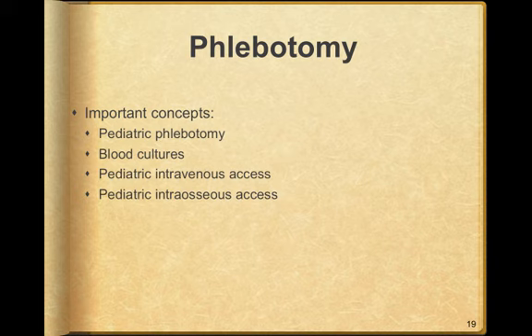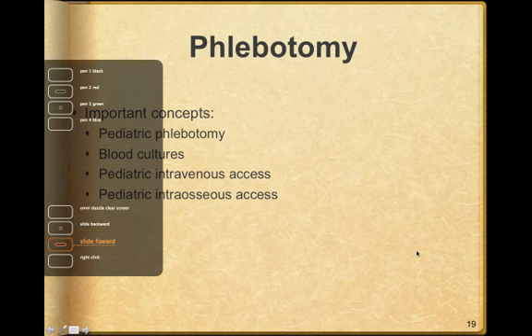Scalp vein access is also a possibility. Butterflies are the easiest to do there. Whenever you make access to the IV, you can tape the butterfly down on the pediatric side. Try to have a cup or something, a styrofoam cup, so that it'll kind of protect the IV site. We'll go over that too in pediatrics.